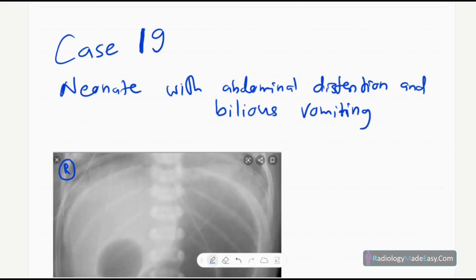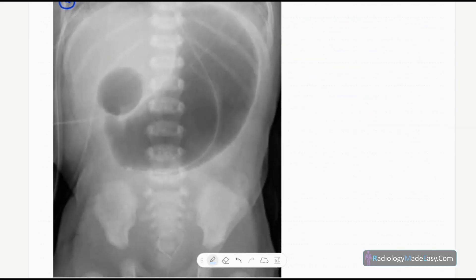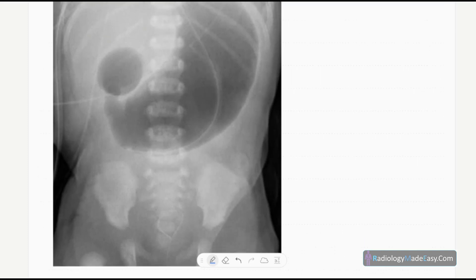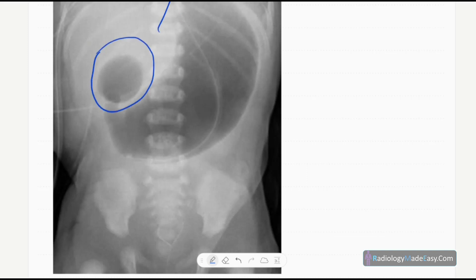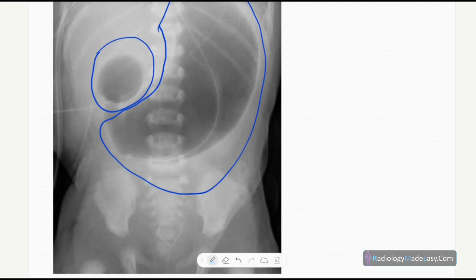This is the anteroposterior radiograph of this neonate's abdomen. At a glance, you can see an abnormality here — two rounded air lucencies, one here and one here. They are relatively large rounded lucencies with air density.